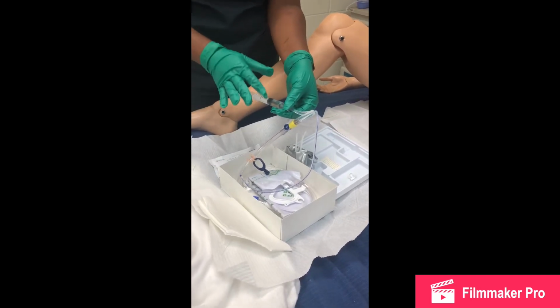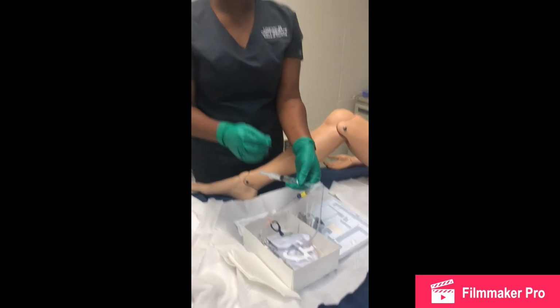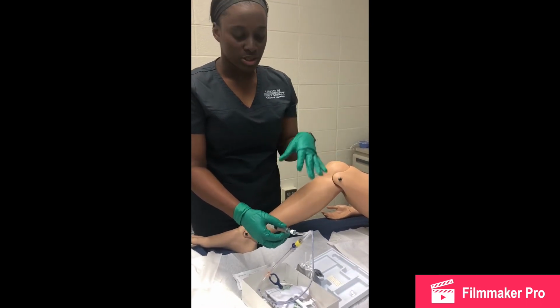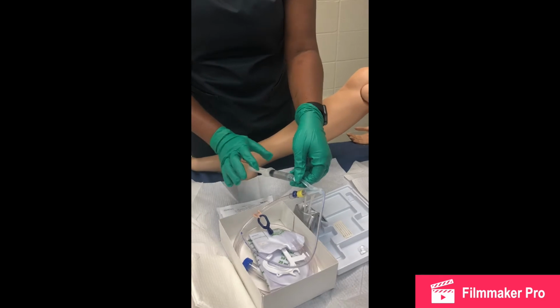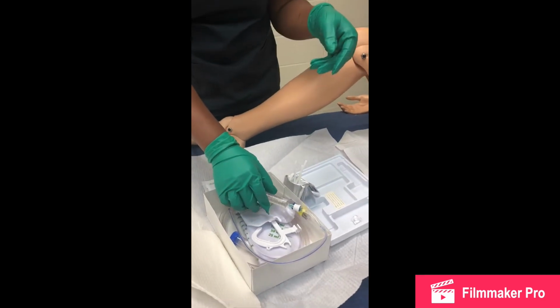Now we could let this syringe stay on this part, or we could take it off, but for this video purpose I'm going to make sure it stays on, because while doing the Foley one of my hands will become non-sterile, so I don't want to risk my sterile field. Make sure that 10 cc is coming back. Okay, so I'm going to carefully place it right here.